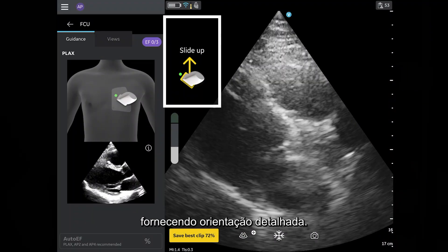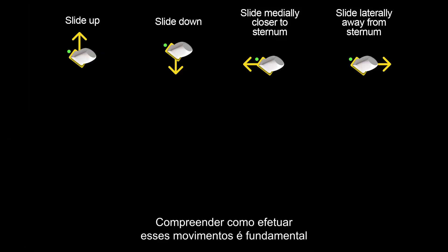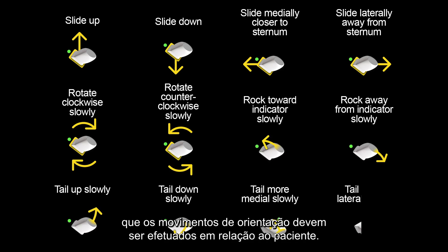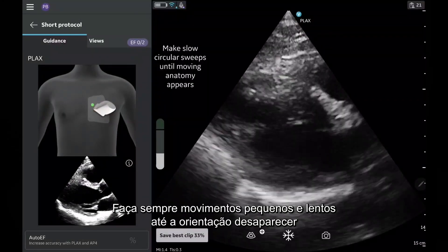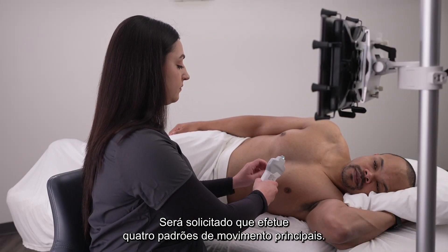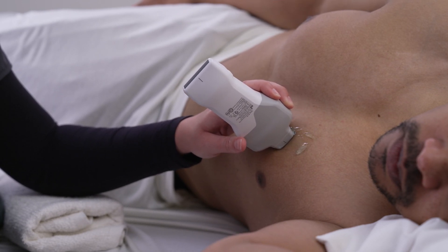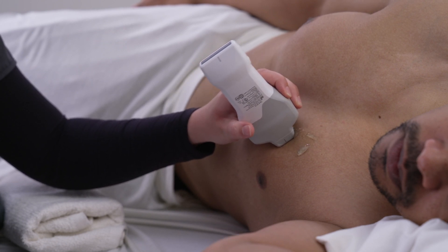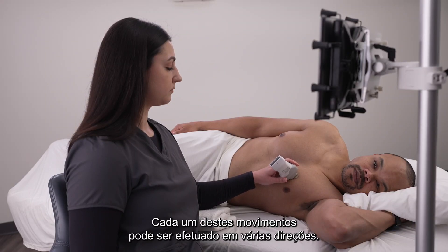Prescriptive guidance appears in real-time, providing turn-by-turn guidance. Understanding how to make these movements is crucial for effective usage of the software. It is important to note that all guidance movements are to be made in relation to the patient. Always make small, slow movements until the guidance goes away or new guidance appears. There are four main movement patterns you will be prompted to make: sliding, rotating, rocking, and tailing. Each of these movements can be made in multiple directions.